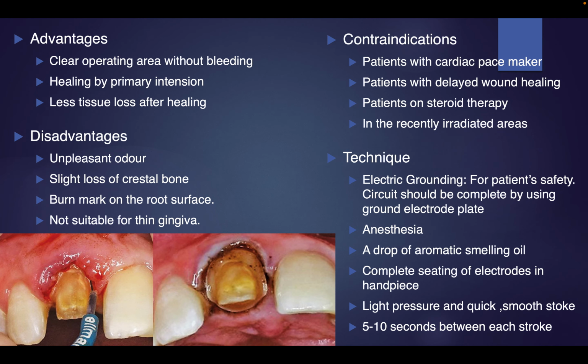It has many advantages. It clears the area and stops the bleeding. But it has a very bad odor, and it can cause bone destruction if it is held or used incorrectly. People with a pacemaker, you should never use it. It's an electric device, so you can stop the pacemaker. Patients obviously have to be warned that it's like a barbecue smell. It has to be very numb, and you have to have continuous movement, which can be tricky.